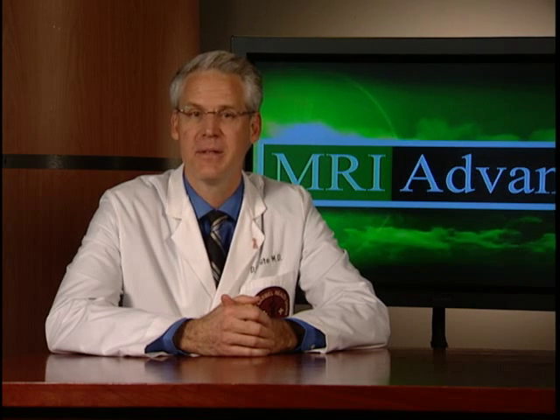We will provide some explanation as to why we have come to this method, and perhaps this will help you develop your own system or possibly modify existing ones. Throughout this course, we try to demonstrate a range of imaging techniques from very basic protocols applicable on every entry-level or older 1.5 Tesla MRI platform to more advanced protocols requiring higher-end MRI equipment.